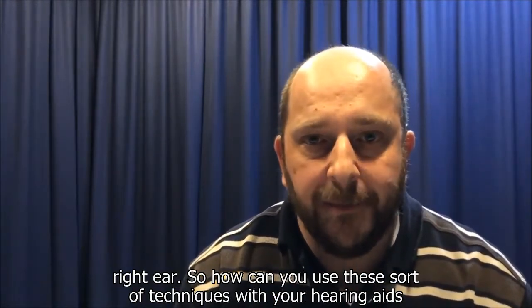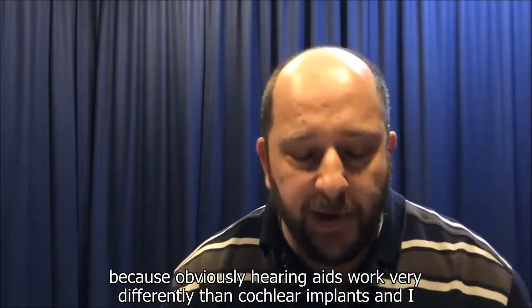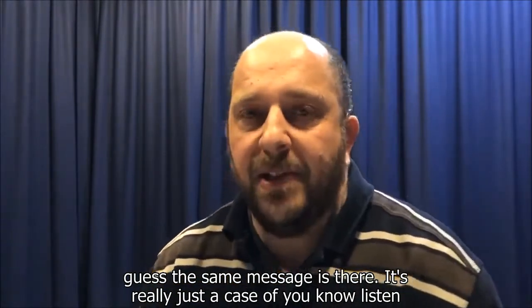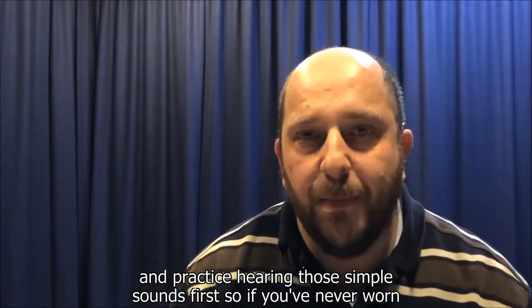So how can you use these sort of techniques with your hearing aids? Obviously hearing aids work very differently than cochlear implants, and I guess the same message is there. It's really just a case of practicing hearing those simple sounds first.